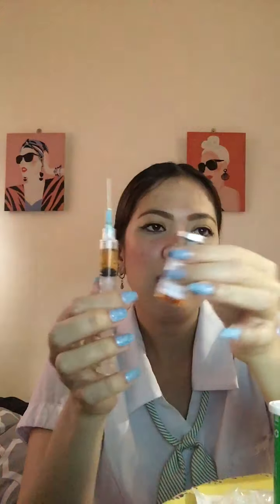Now the fourth step is to attach the filter needle to draw up the mixed liquid medication from multi-dose vials. Then remove the cap from the needle, then draw up into the syringe. I did this earlier. I drew about 3 ml of medication from the vial. Air must first be injected into the vial to prevent the buildup of negative pressure in the vial when aspirating the medication.